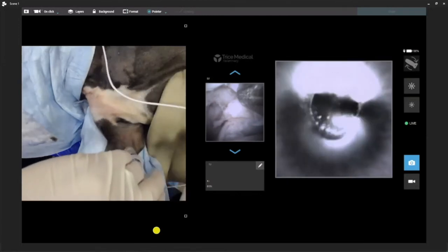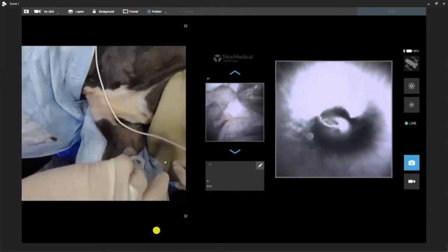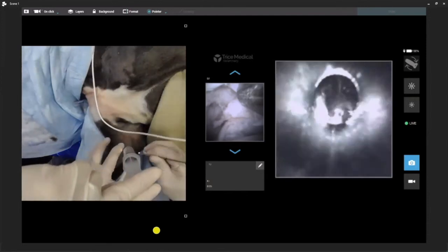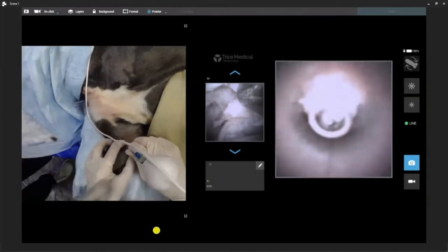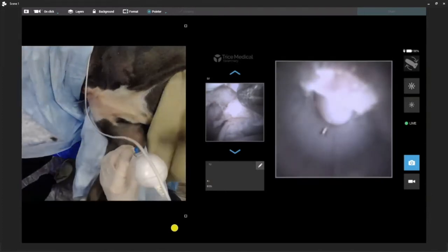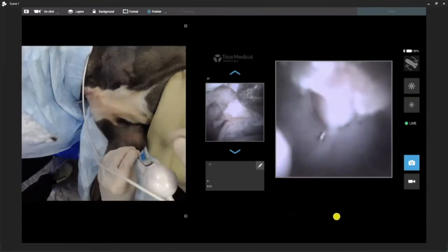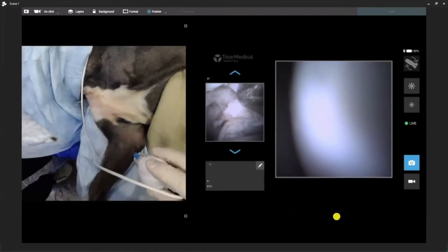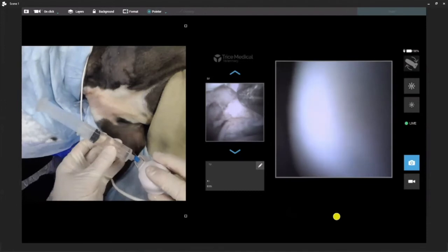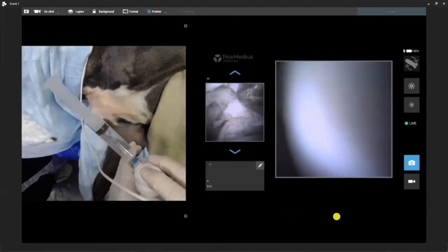I have my assistant hold the needle. Make sure our optics are retracted. I'm going to use a pencil grip — choke up on this, look where the needle is, come on the side: one, two, three. She pulls out, I just slide in. You can see how easily that goes. Now we're going to engage our optics. There's fluid coming out so we know we're in the joint. For ease of use, we'll just use a syringe for our fluid — catch that, and let's go ahead and drive around.